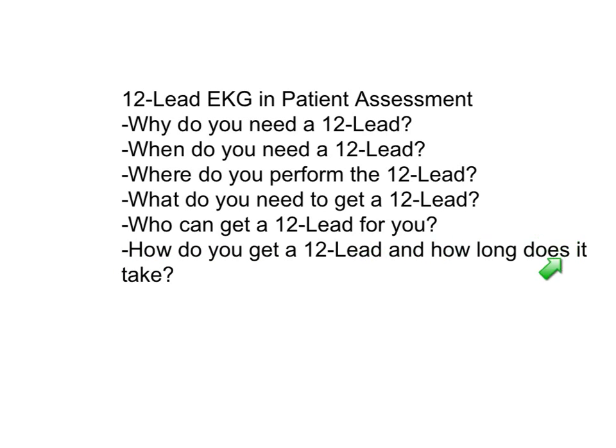How do you get a 12-lead? How long does it take? Pretty simple to acquire one. Again, hook up the wires, have your patient remain still, try to minimize any movement, push the 12-lead button on the monitor, and it will take about 10 or 15 seconds. How long does it really take, start to finish? Probably 2 or 3 minutes, if you're working on it rapidly, from the time you decide you need one until you have the printout. So again, just a quick overview.